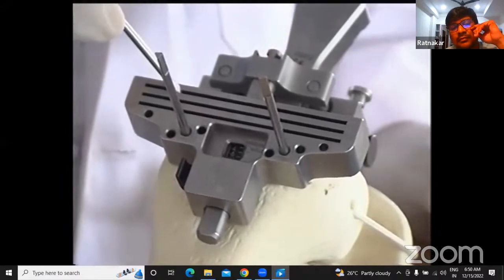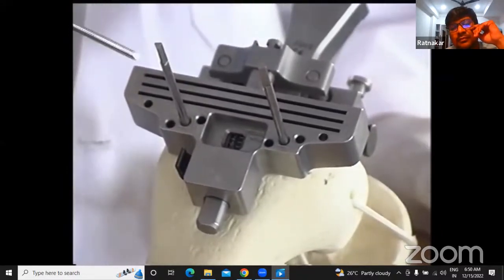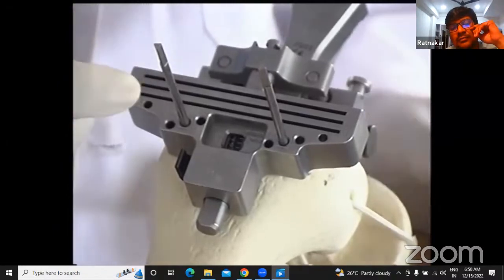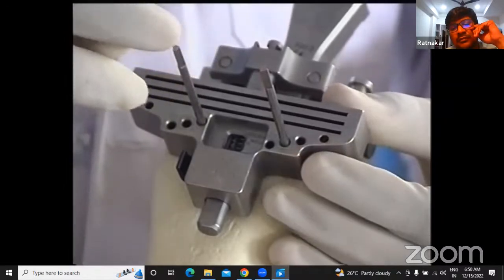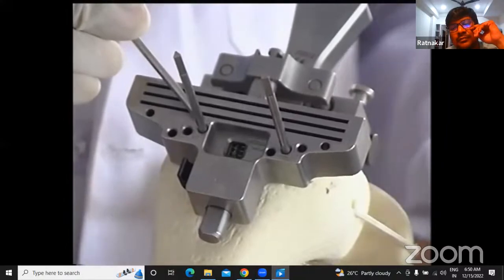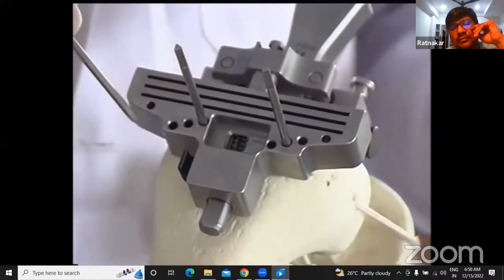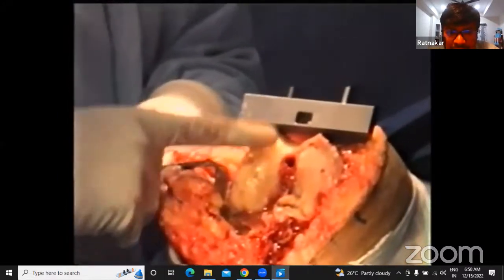For example, in tight knees or in knees with flexion deformities, if you want to cut more, then what you have to do is move these pins into another slot, which is indicated by +2 here. You can see that is +2. That means you are cutting 2 millimeters more. Now, we are ready for the distal femoral cut.